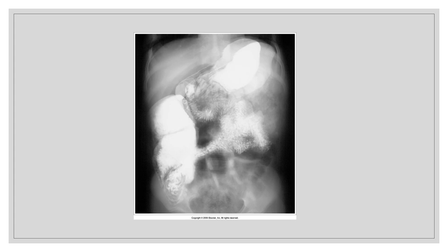What type of artifact? Equipment. This is a double exposure. You can easily see one stomach and then a second stomach. And then you can also look down and see other anatomy if you follow it down.